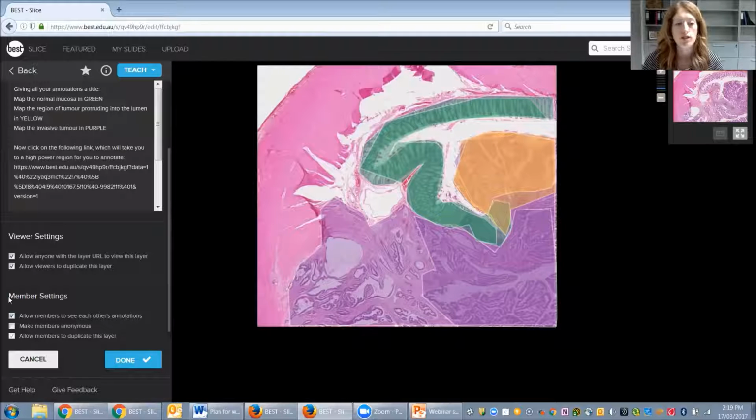When you've got the settings on as students' names appearing, you can see this toggle option appears, which wasn't there in the anonymous activities. Because everyone's organised based on their own individual annotations, we can toggle the focus to highlight one person's annotations on an image at a time.